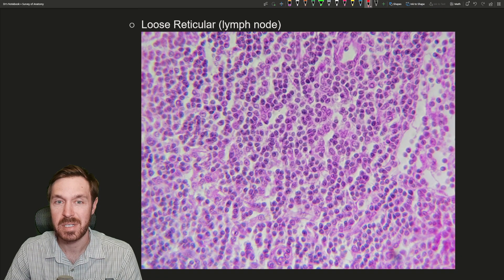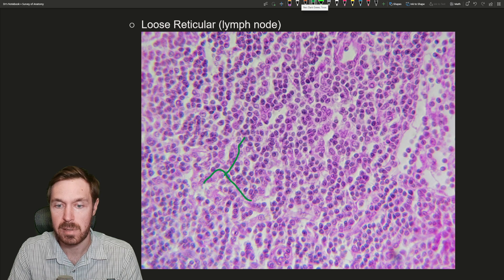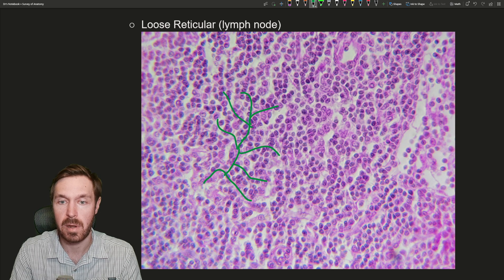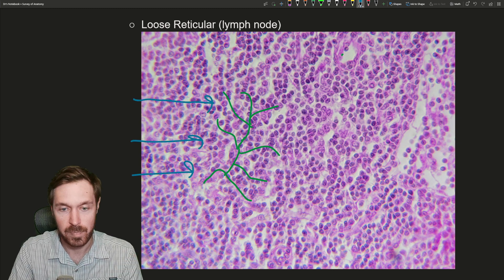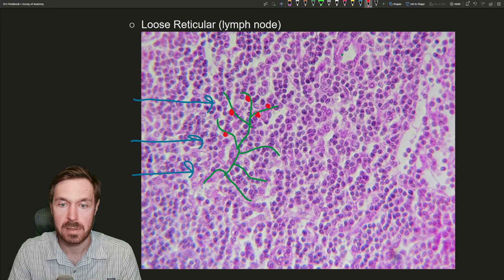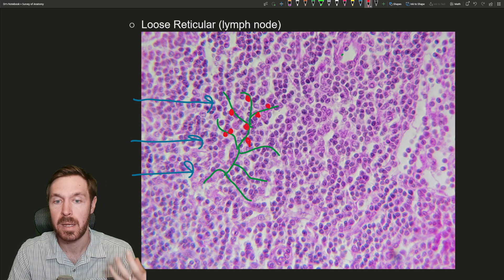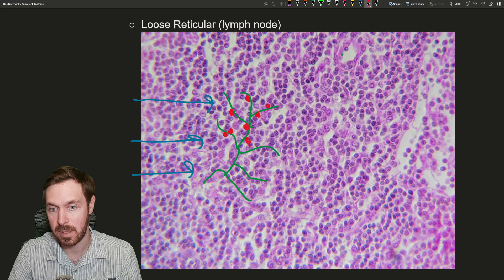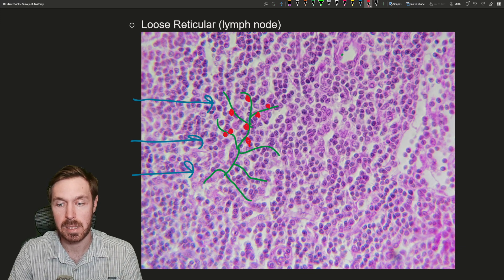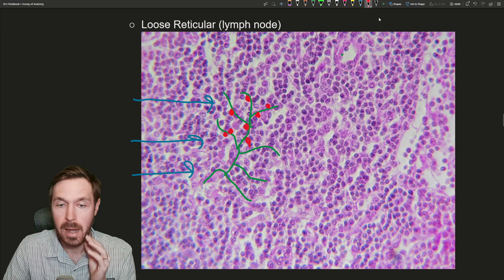Next is loose reticular, which brings in reticular fibers — they aren't differentially stained in this image, but these branching reticular fibers would be present. This example is from lymph nodes, where fluid moves through and gets cleansed. Macrophages and B cells seed themselves on these reticular fiber scaffolds. As lymph fluid moves through, if there are any microorganisms or immune activations, these cells can be activated and undergo proliferation. Loose reticular fibers are also found in the spleen, where a similar process occurs.